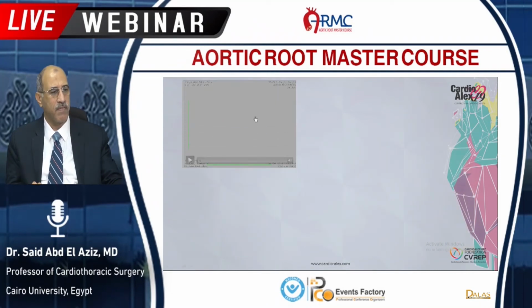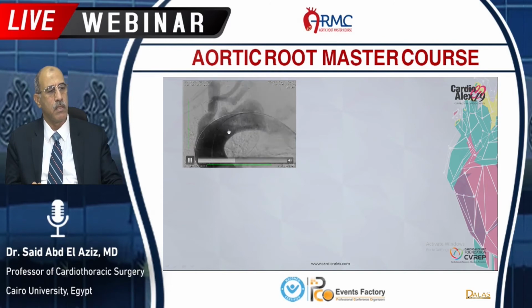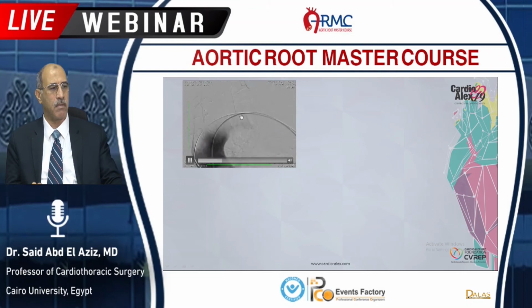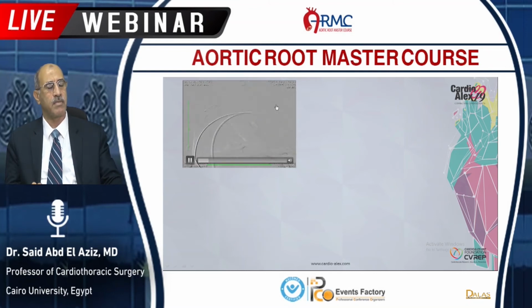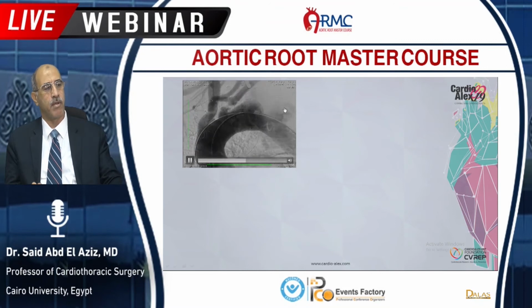Here is a video that I will show to you. As you see here, the guide wire is inside the descending aorta and the arch, and we inject the contrast and see here a huge descending thoracic aneurysm.